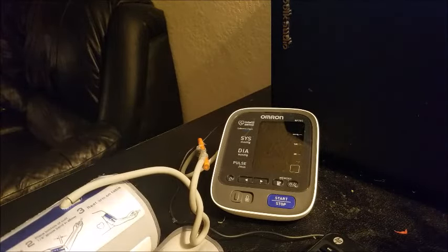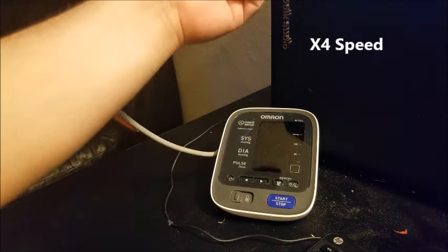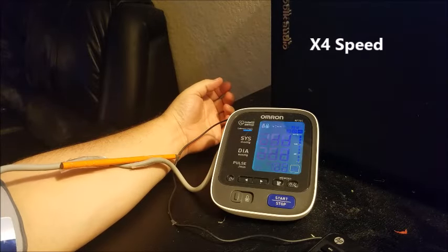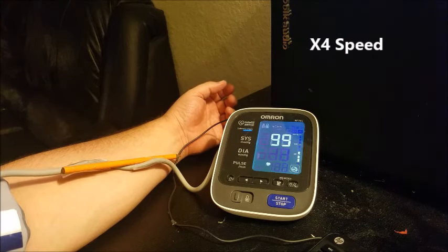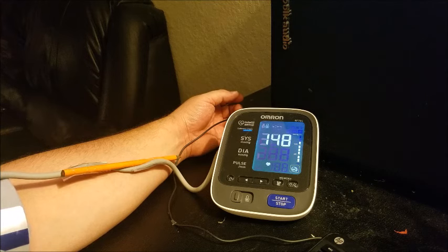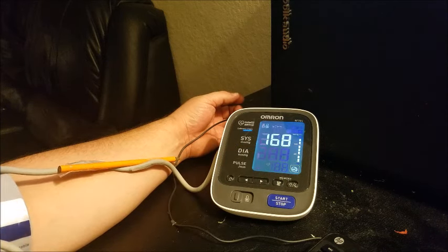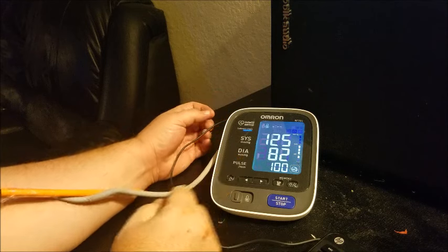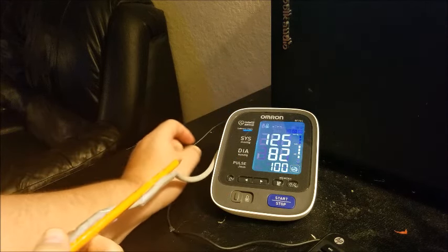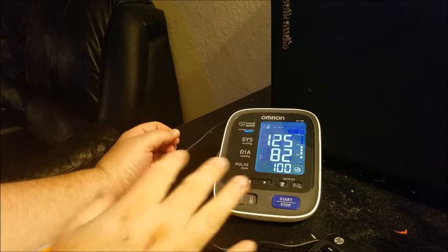I was getting that error — now let's try it. You can see the reading here, it says okay, which means I got the cuff on correctly and it's making connection. 125 over 82. So as you see there, it works when I fix the kink in the line that goes from the cuff to the machine.